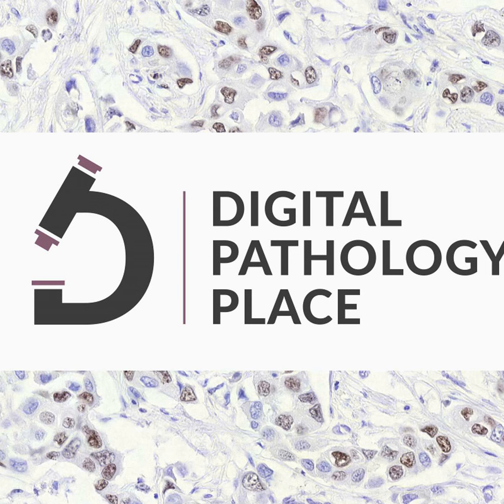So let's address a question. Question from Rita: for how long should we retain the digital image? Same as the glass slide. Yes. So this is all in the institution standard operating procedures, but basically, because this is what the data was generated from, it has to be retained as long as all the other study material. So yes, it basically becomes another piece of data in this instance because it's digital, but another piece of something that we have to keep with all the other stuff that we're archiving for a study.